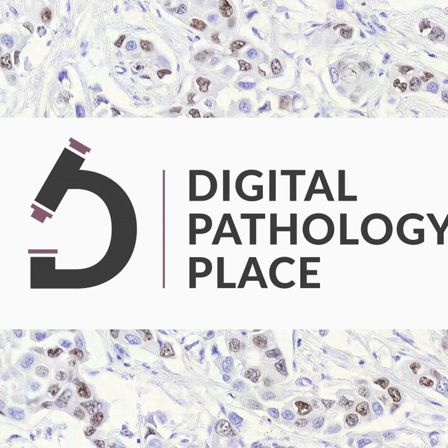And this is a very diplomatic way of saying they look so bad sometimes compared to an FFPE specimen. Like, they don't look great because you have cells, smears, and the level of interpretative effort when doing cytology is so much higher than when doing anatomic pathology. So that is the problem, because they are not thin enough, not even enough.